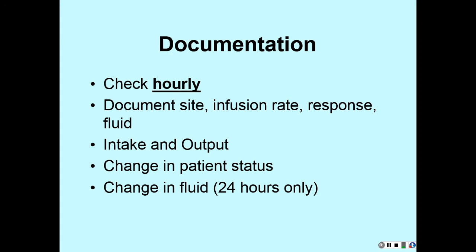When you're troubleshooting for an IV, you want to start at the site and work back up to the pump. Okay. So look at your site. Is it red, swelling, irritated? Is it leaking? Not good if you see pus up under the Tegaderm. Not good. Okay. Is it hard? Is it very sore to touch? Is it hot? Is it warm? That's not normal.